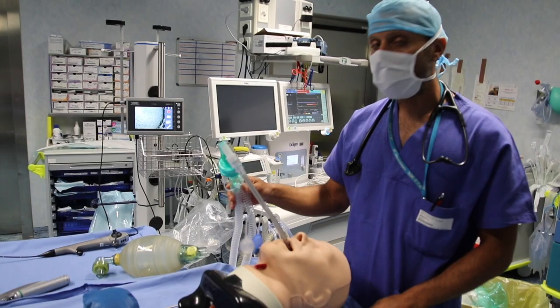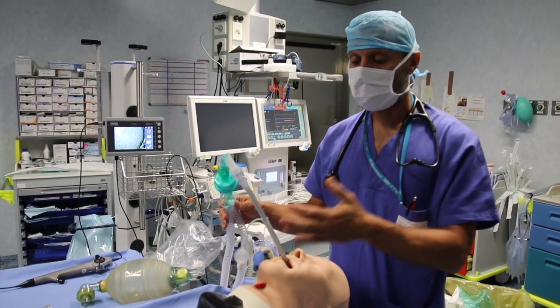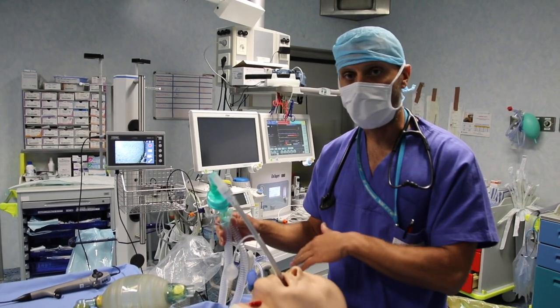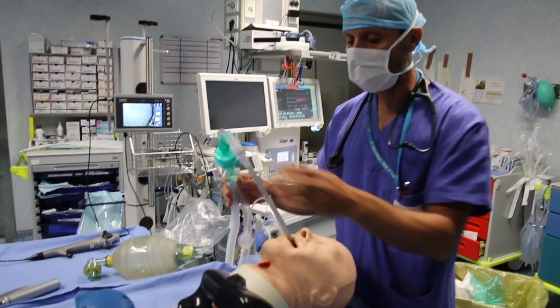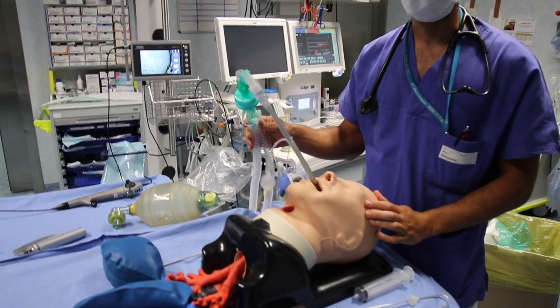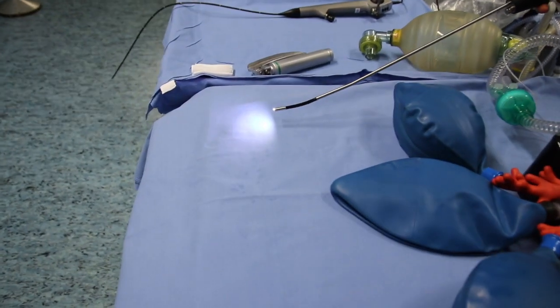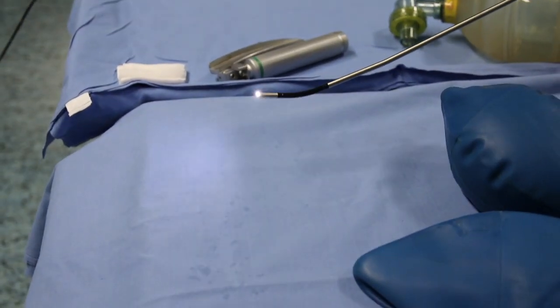In the previous video we showed how the Spritz tube is used for intubation with a video laryngoscope. Now we'll describe another possible method using a rigid type endoscope, like this video stylet by Stortz, that has a rigid body and a flexible tip that can be bent up to 90 degrees.